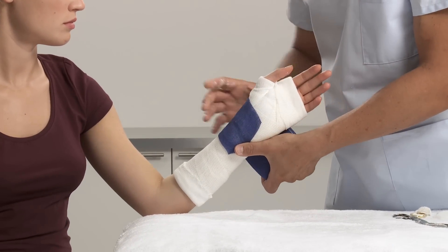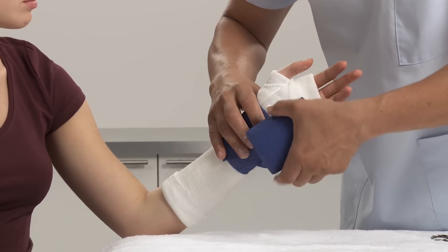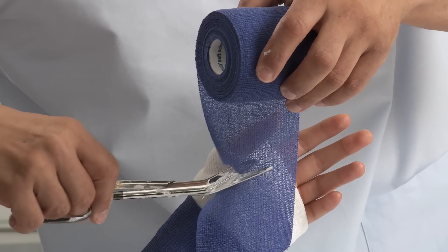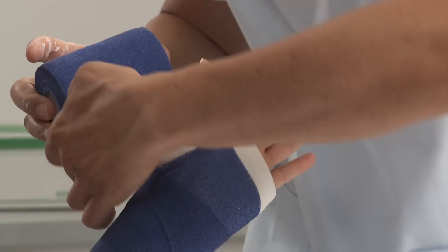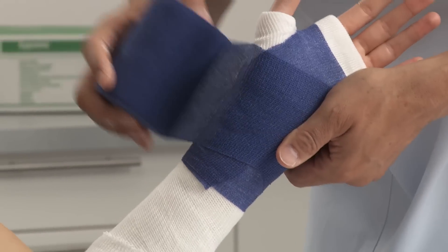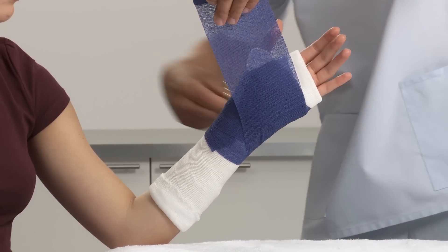Using a second bandage, wrap distally to proximally. Anchor at the wrist and wrap twice through the webspace and around the thumb. Proceed up the arm, overlapping the bandage by 50% and fix.